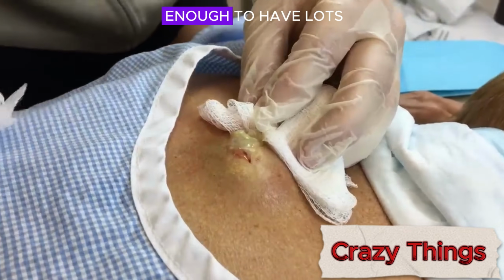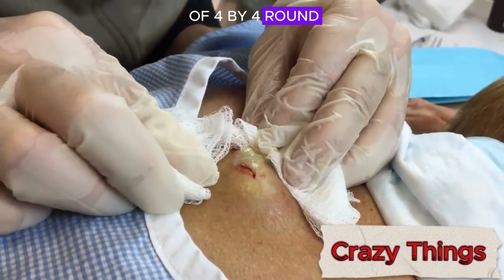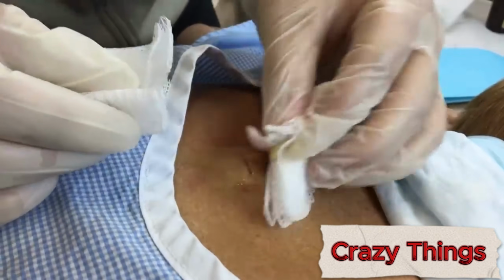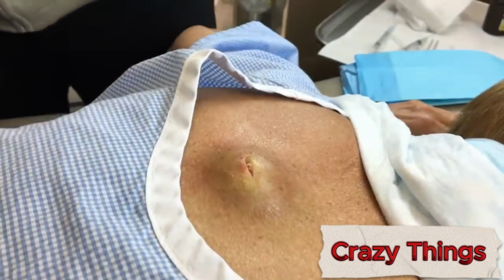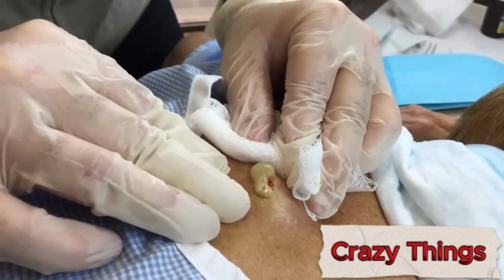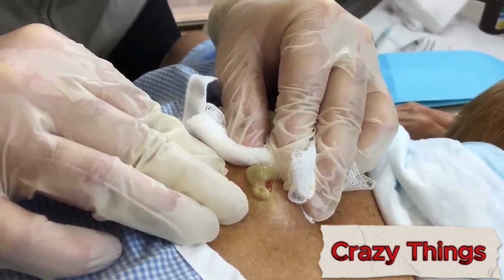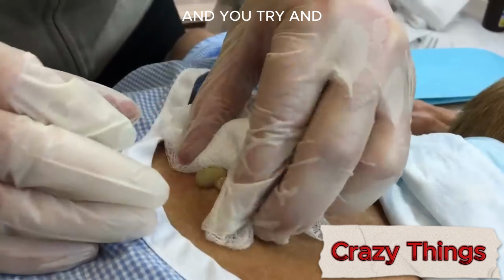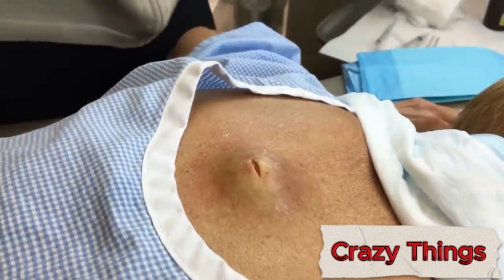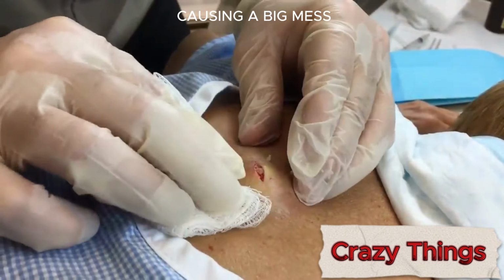And I can't stress enough, you should have lots of 4x4s around. So you start to see some pressure. And you try and find a balance between putting a little bit of pressure so you can get this to drain without causing a big mess.